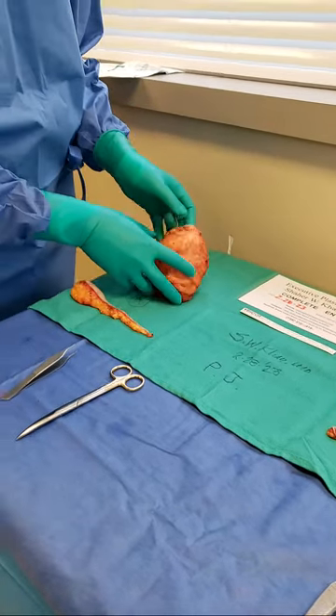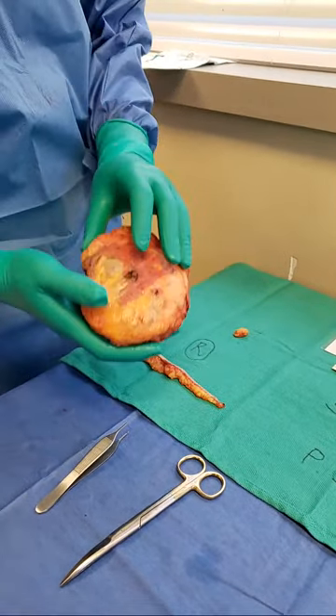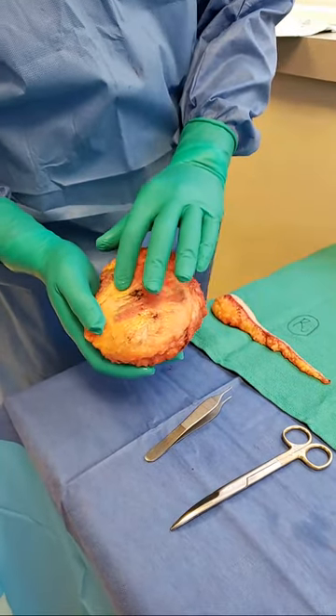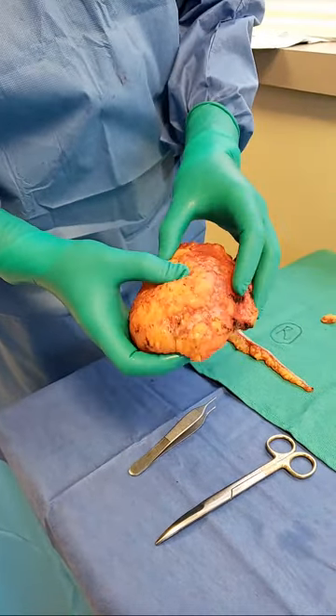This is the implant on the capsule. If I touch it, I can see it's hard. There are some areas that are so soft — you can see it's almost transparent. So if I pass my finger, this is so soft and it doesn't take much to kind of cut into it as I'm dissecting. Look at the irregularity right here.